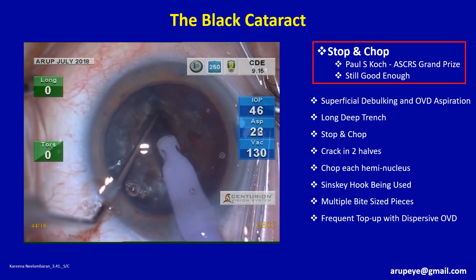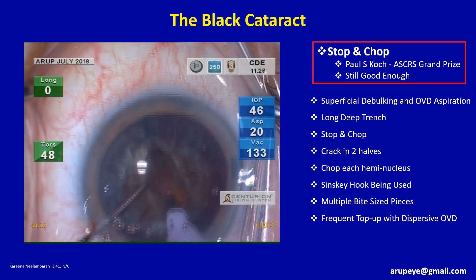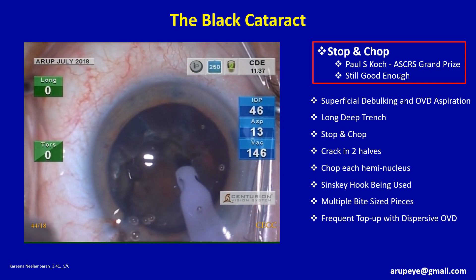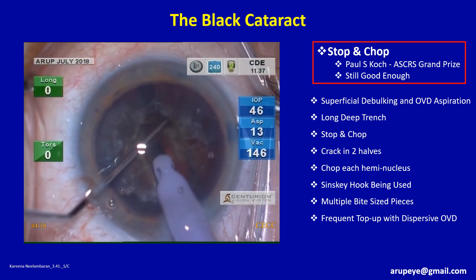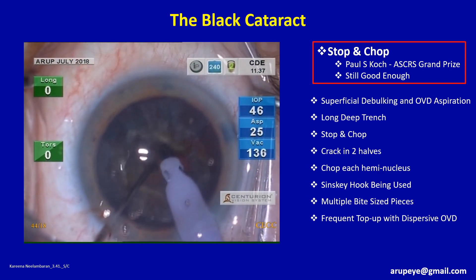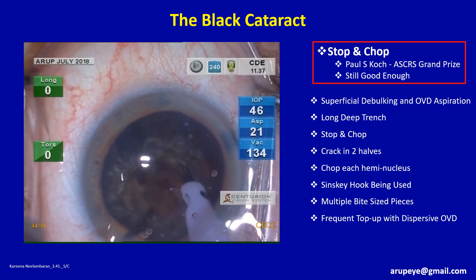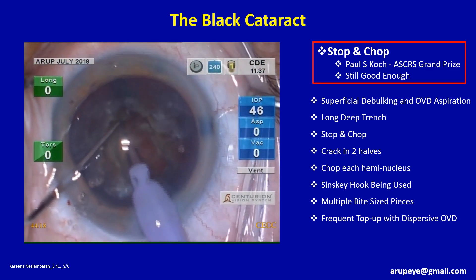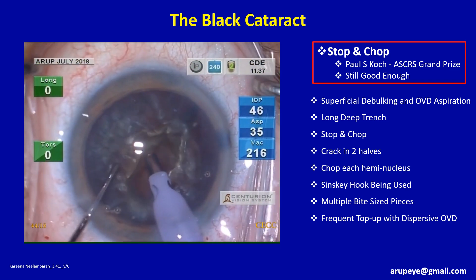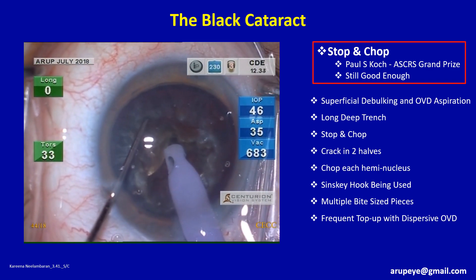Tendency for excessive lateral separation should be resisted and the mechanical forces should be applied very close to the developing cleavage line at the bottom of the trench. If necessary, additional lens matter may have to be shaved off from the floor of the deep groove. Cracking is initiated and as the crack line develops, the instrument tips are moved more proximally till the line of cleavage reaches the sub-incisional area, separating the nucleus into two halves. All these maneuvers are to be performed with a deep anterior chamber by repeated topping up with dispersive OVD. Each of these two halves will now be chopped into multiple pieces, with parameter settings altered — the vacuum is raised and the power dropped proportionately.